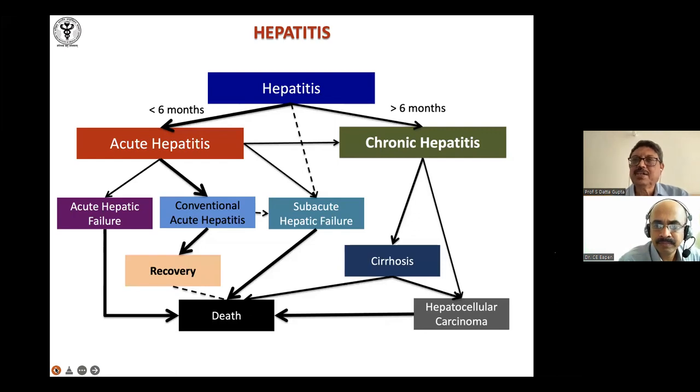There are different types of collagen: collagen 1, 2, 3, 4, 5, 6, and so on. Now, the reticulin stains a specific type of collagen that is found especially in the basement membrane, lining vessels, lining capillaries, and so on. And because it's closely associated with the hepatocytes, it helps us in giving subtle changes in the architecture.